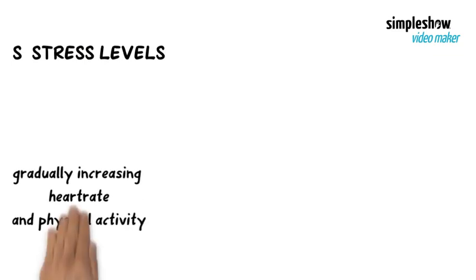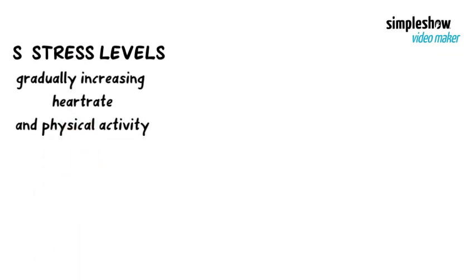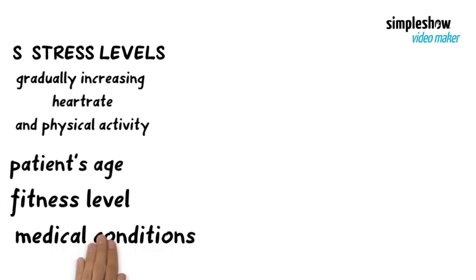S. Stress levels. The stress test aims to increase the patient's heart rate and workload gradually, simulating the stress on the heart during physical activity. The stress levels are adjusted based on the patient's age, fitness level, and medical condition.